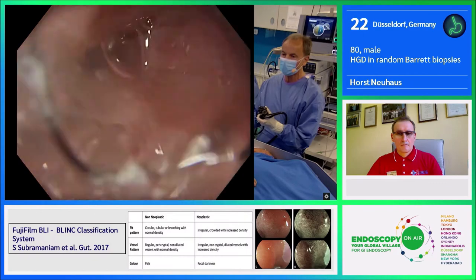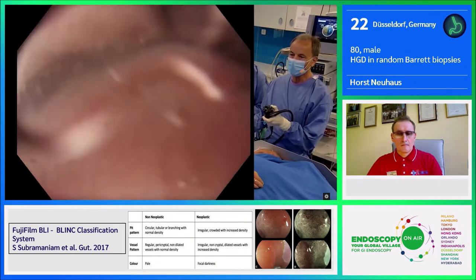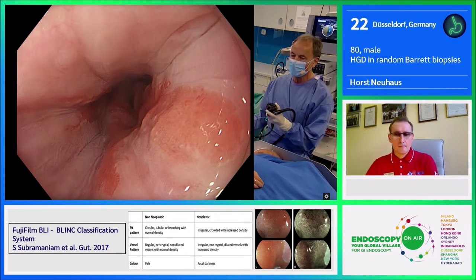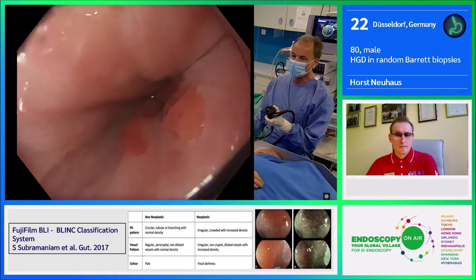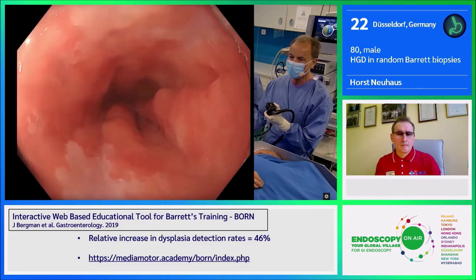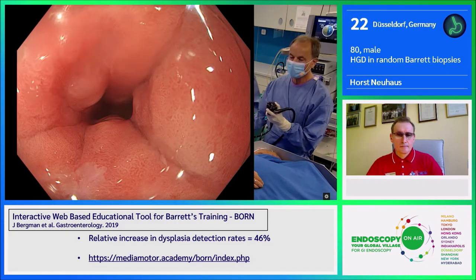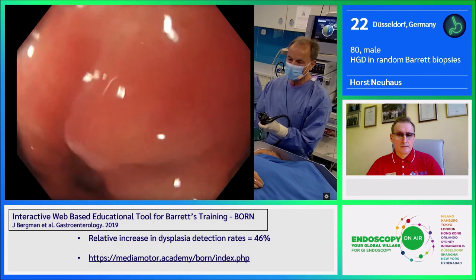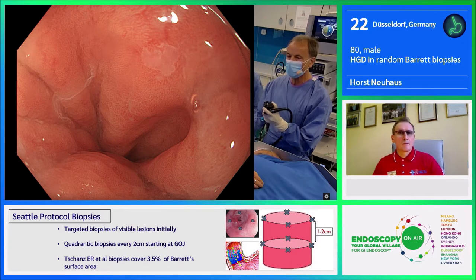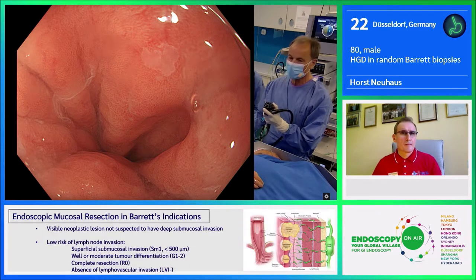This is now white light, and you can appreciate the high resolution approaching the deeper part of the oesophagus. Here we see the first tongue of Barrett's at 41 cm, then tongues and at 44 cm circumferential extension of Barrett's. We now identify the EG junction, clarified by the proximal gastric folds, with Palisades vessels at 6 o'clock. Small squamous cell islands at 1 o'clock mark the EG junction area at 47 cm — so we have a C3M6 Barrett's.